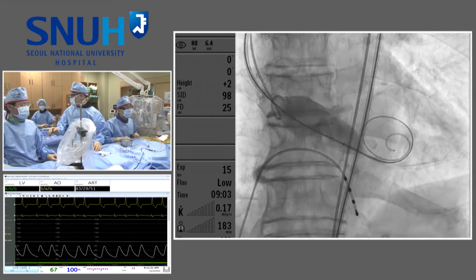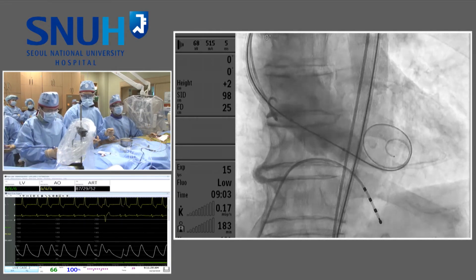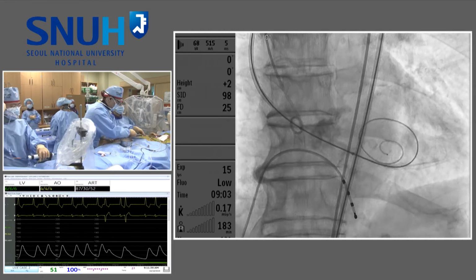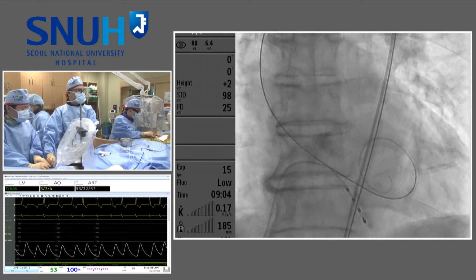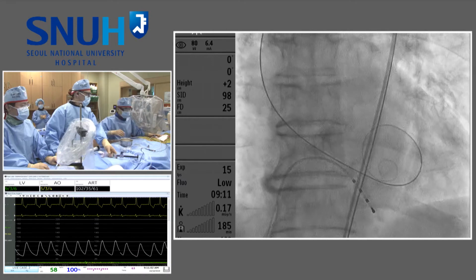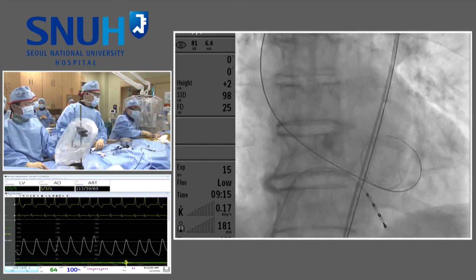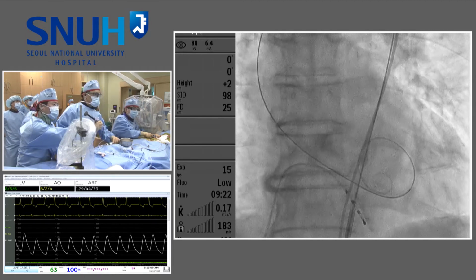I think this is an interesting case. I mean, obviously, Dr. Kim is very experienced, and it's his decision and his choice. It would be interesting to see what the panel is thinking, what kind of valve and what size of valve, because this is really a very difficult TAVI case, given the amount of calcifications, the chunk, it's not circular, and the size, bicuspid. I'm not sure whether I would follow the SAPIEN approach in this case, but obviously we will see. I would just be afraid. You can see that the calcification moved into the sinuses, and did not affect the left main.